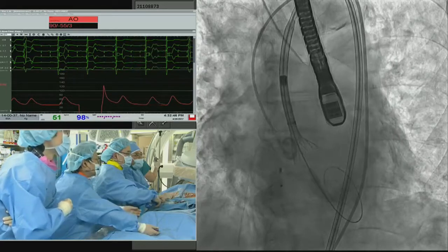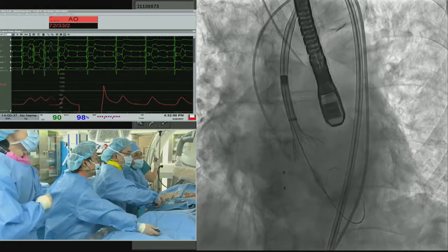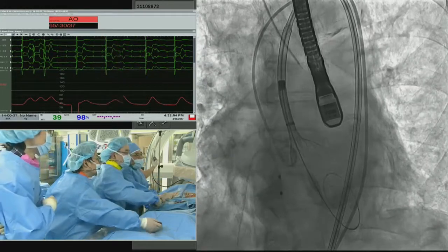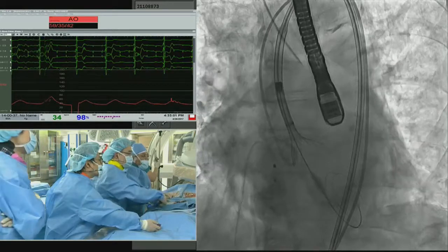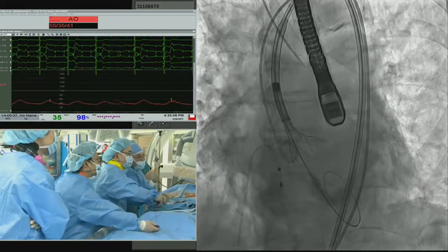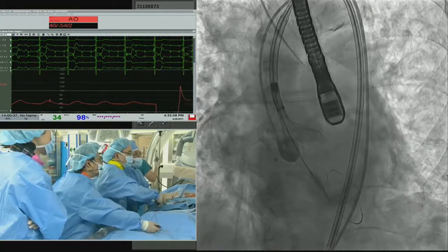What about the risk of stroke after multiple recaptures? Slowly. Theoretically raised. There's some pressure down now. Yeah, you don't want to pop out. At this moment, I prefer the pacing. We analyze our experience with recapture. Testing. Okay.